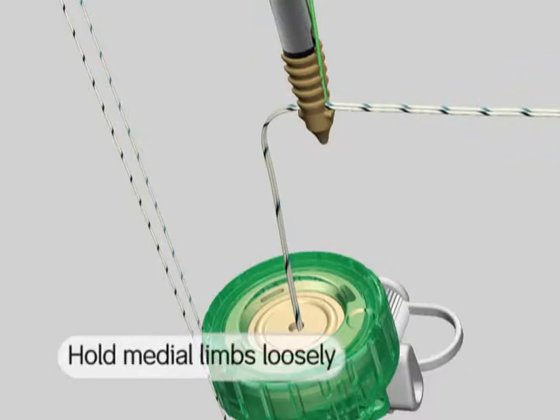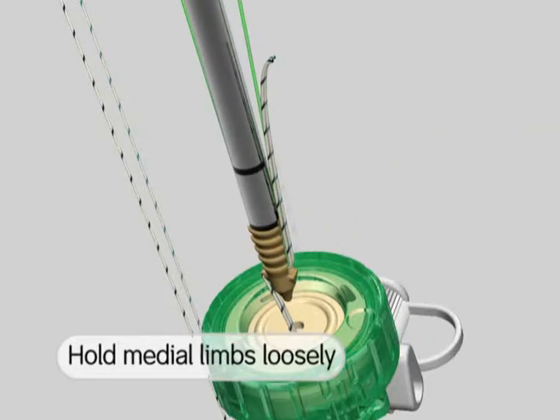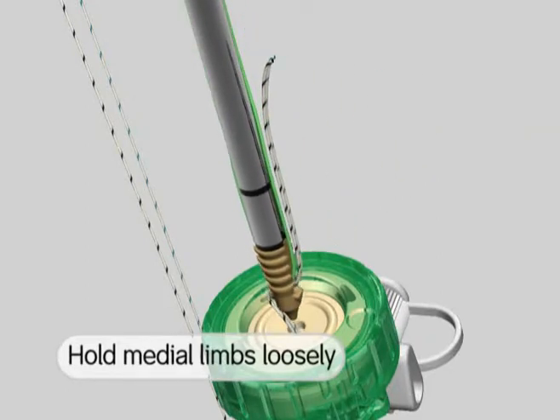While keeping some slack in the free medial suture limbs, advance the anchor into the joint towards the prepared hole.